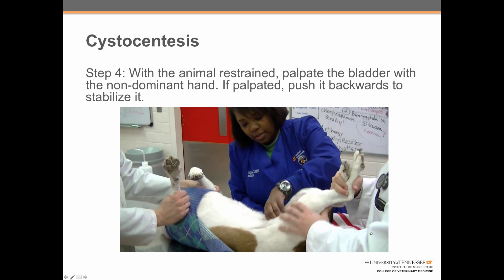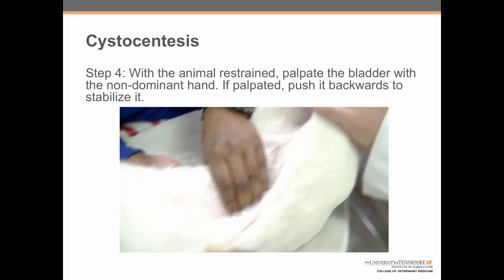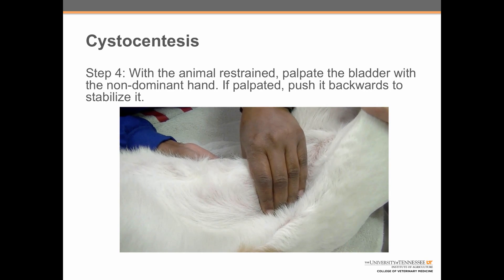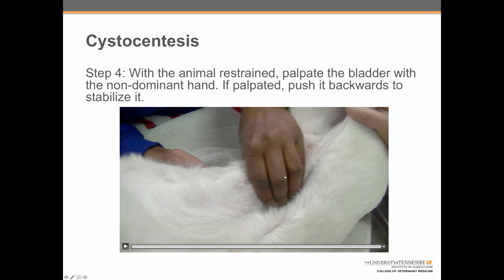Step four: with the animal restrained, palpate the bladder with the non-dominant hand. If palpated, push it backwards to stabilize it. Here we can see Shanna feeling for the dog's bladder. Once she has it captured, she is going to push it backwards to hold it stable for aspiration.